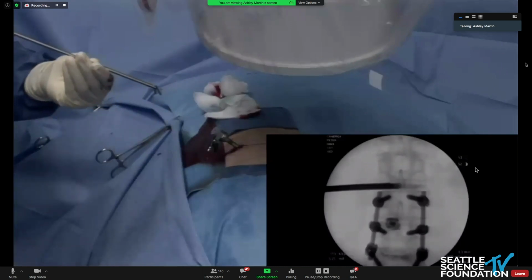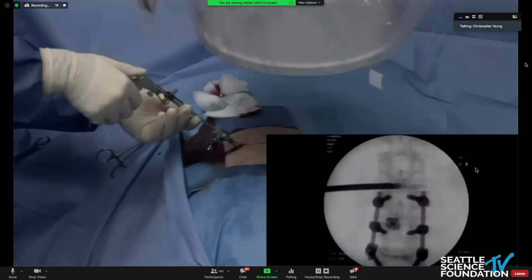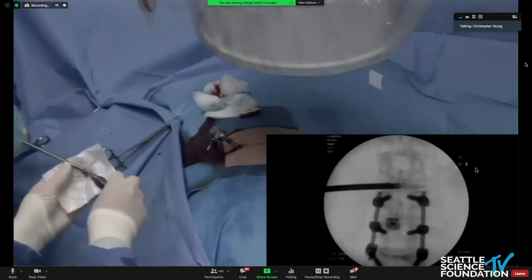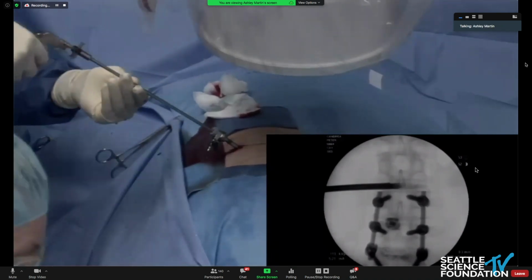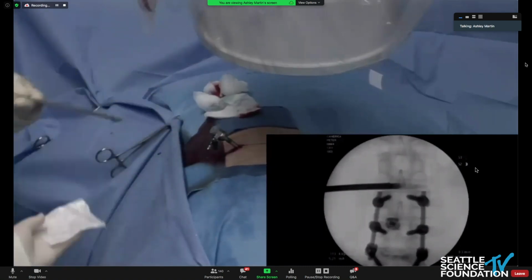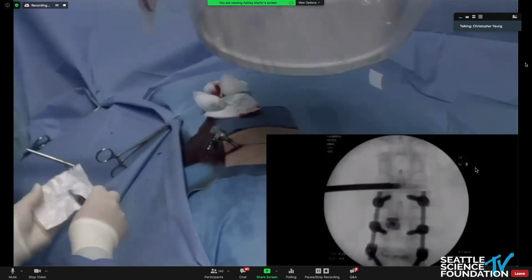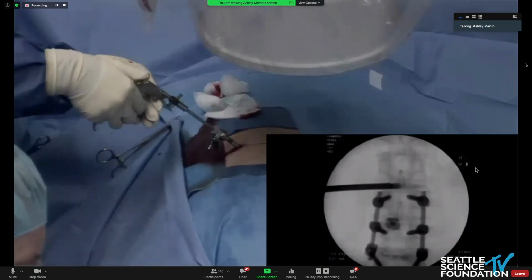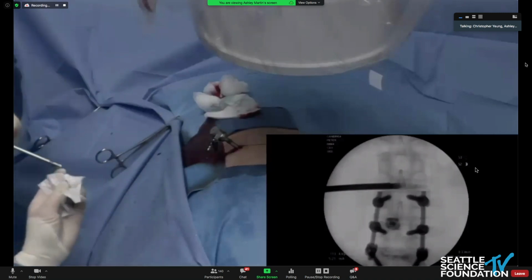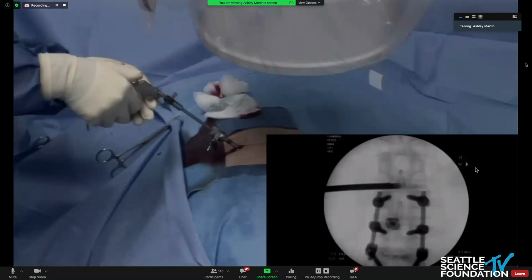So here's how you know that. You basically will be getting all the loose and unstable nucleus, open up until it exits the cannula, and you can kind of feel it without taking so many shots. You do it right at the entry zone to the foramen.